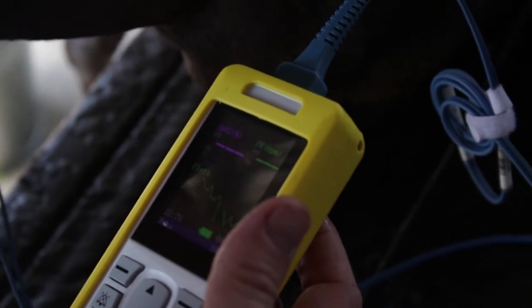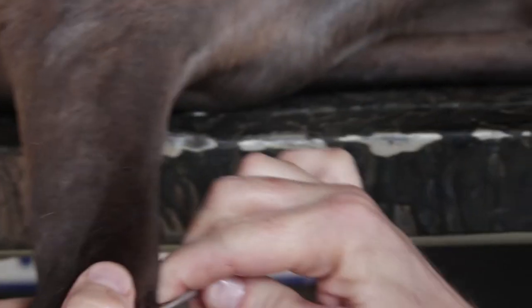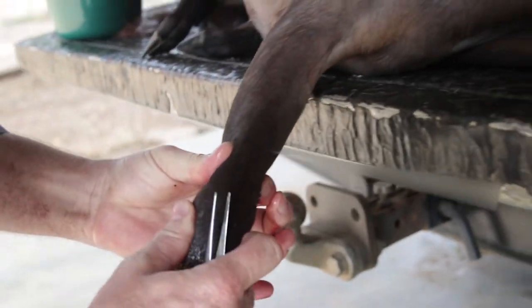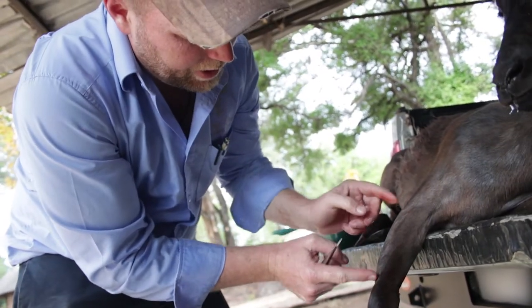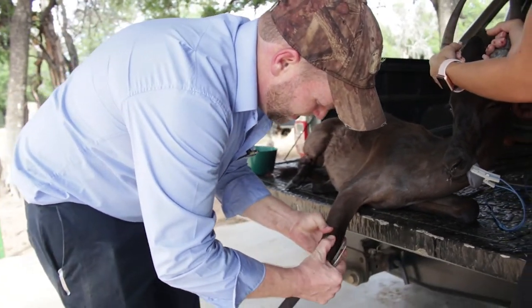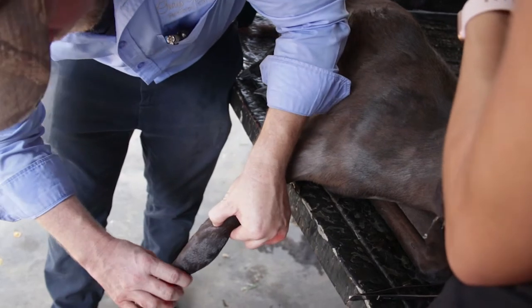So let's see if that stays on. That's your SpO2 - you want it to be in the 90s. It will start to pick up now. We're just trying to put it back and see where the alignment is. The problem we've got is there's a joint here, so you've only got that much there and then you've got this piece up here. You can't really work in a joint - putting stuff in the joint is a hassle - so we see how much distal bone we have to work with.